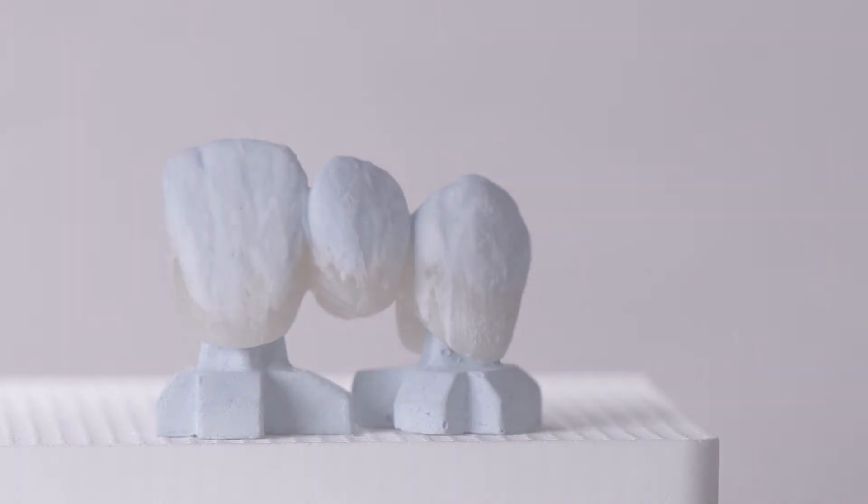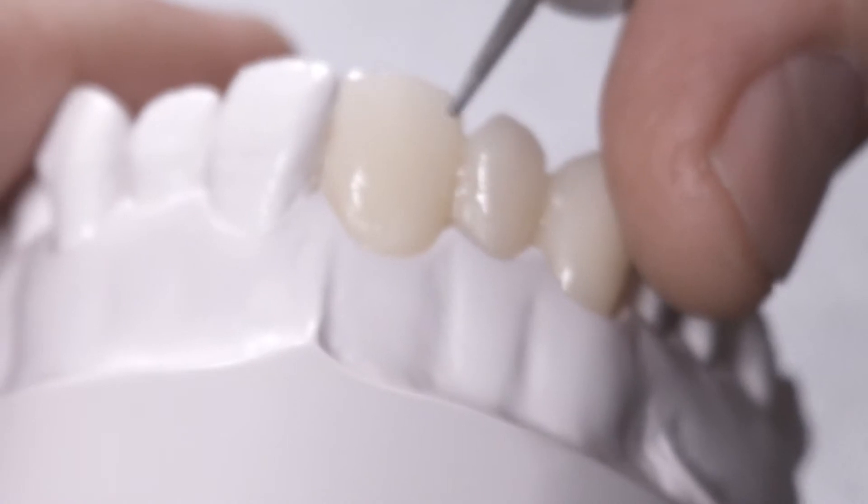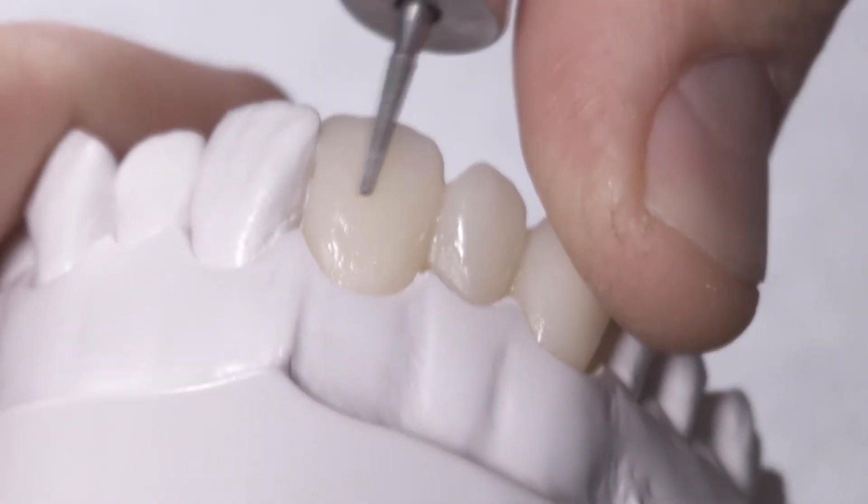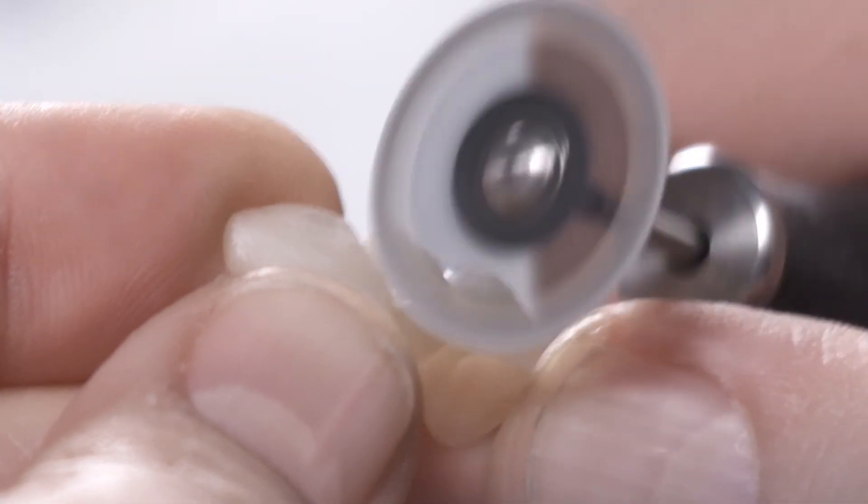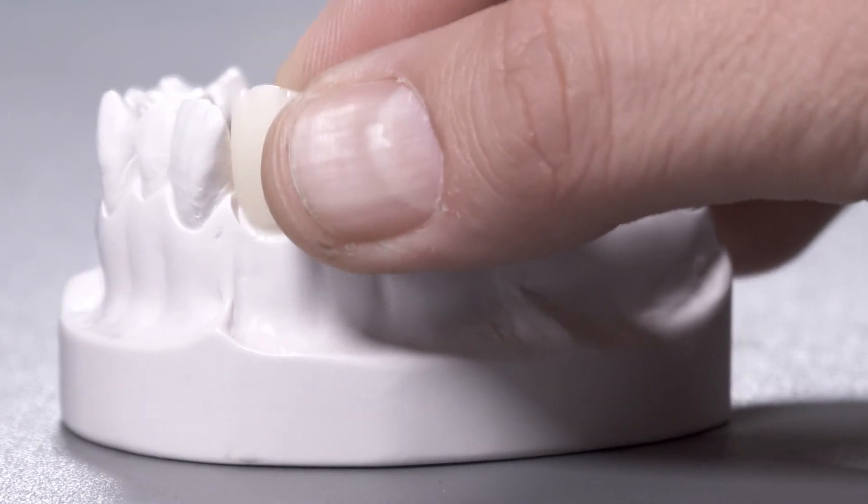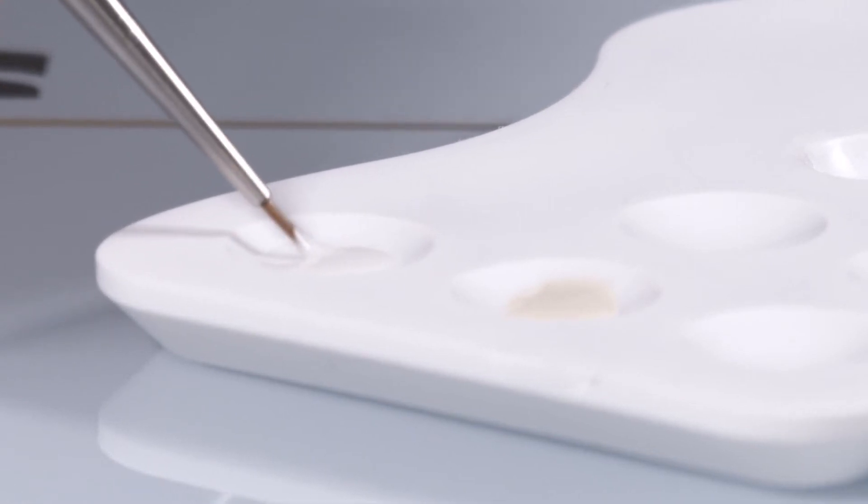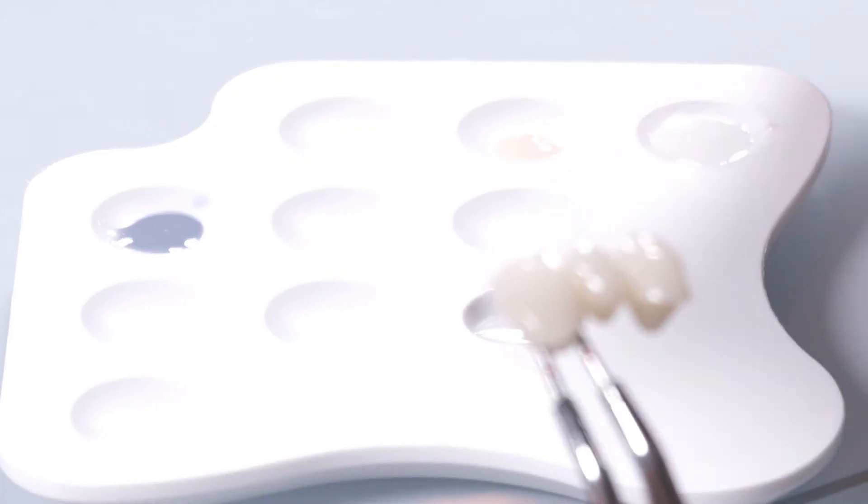After ceramic firing, finish the shape and surface texture. With this method, finalization with glaze and stain is achieved in a single step.